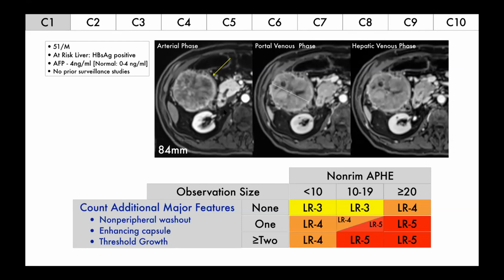So the first thing I tend to do is I keep only the top phases, the arterial, the portal, and the hepatic venous phase. Typically, this is acquired between 25 seconds and the hepatic venous phase at about 2 minutes. So within those 2 minutes, I acquire these phases and I look for the temporal phasicity of how this observation is behaving during those 2 minutes of scanning time. So let's look at what happens on the arterial phase.